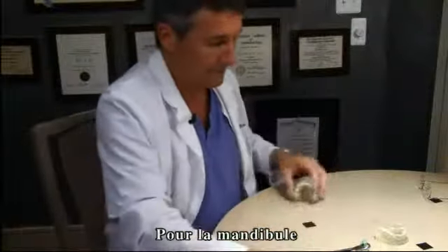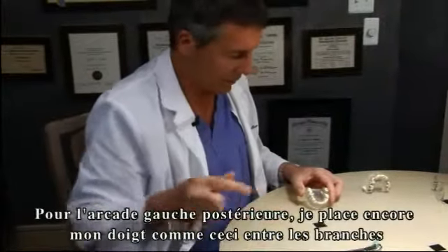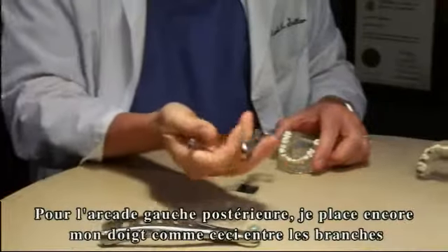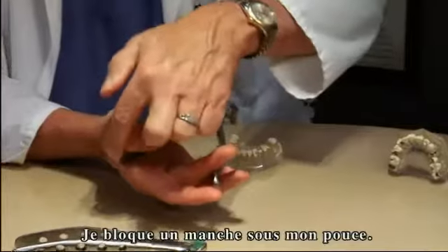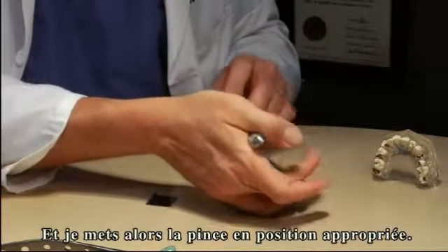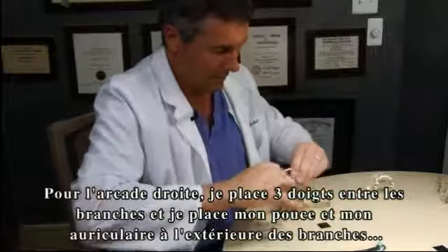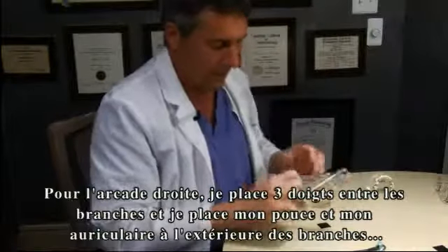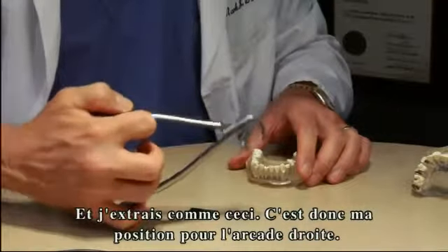For the lower arch — lower left posterior — I've got a finger positioned between the beaks. I'll lock one handle between my thumb, the other off to the side, then position accordingly. For the lower right, I put three fingers between, hold it between my thumb and my baby finger, and deliver this way. That's the lower right hand position.